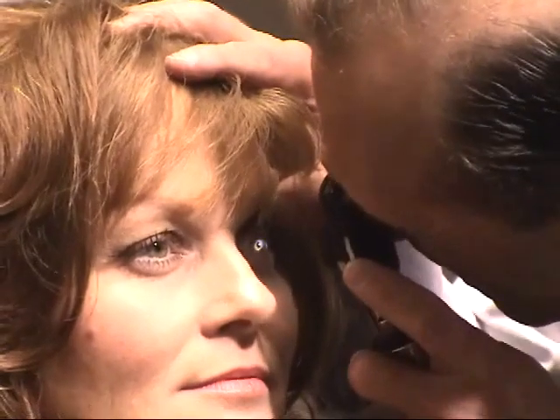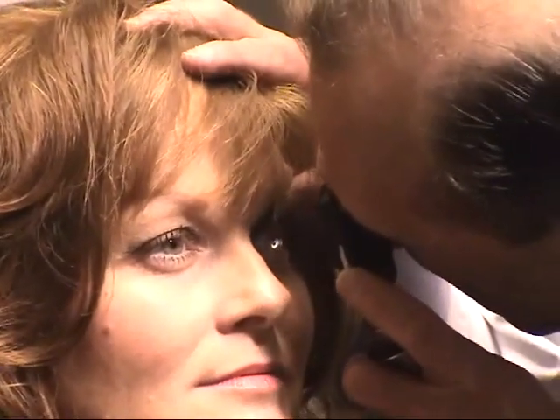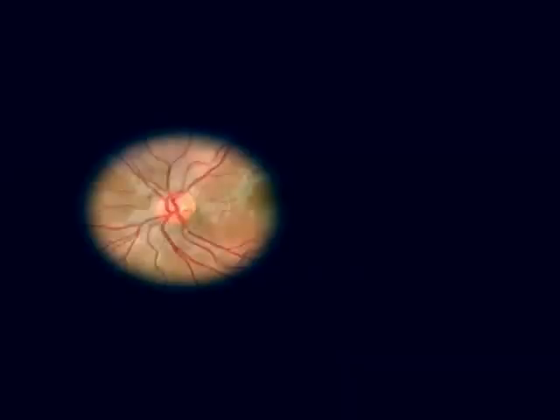Aim the beam at the optic disc and dial in whatever dioptric power you need to get it in focus. Decide whether the disc margins are sharp, whether the disc is normally pink or abnormally pale, and whether the optic disc cup is abnormally large.